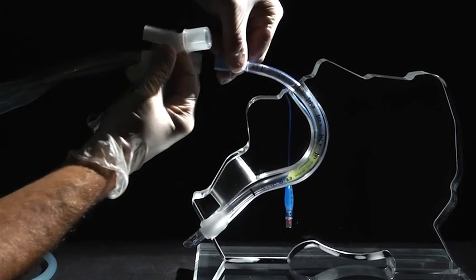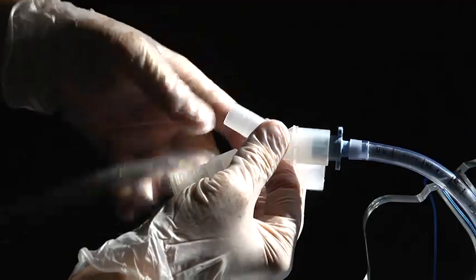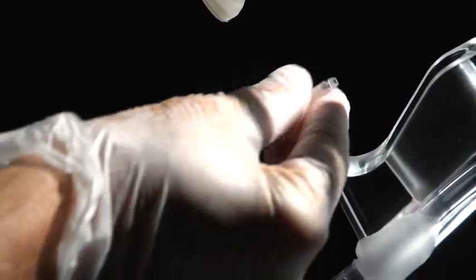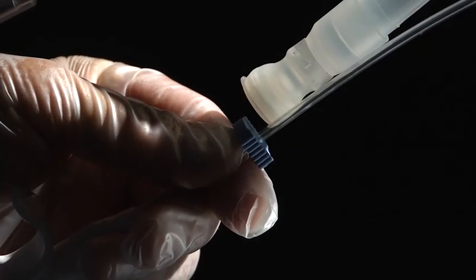The Endoclear BCA adapter is inserted into the ventilatory circuit. The tip is lubricated and the device is inserted to the pre-measured blue depth stop.